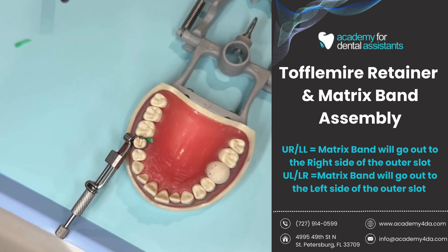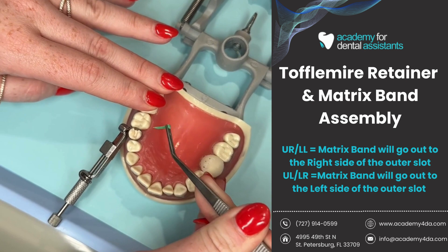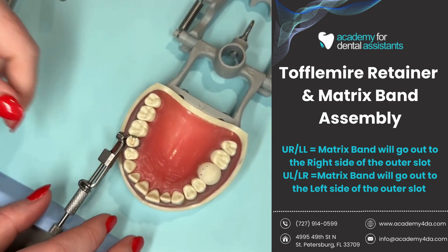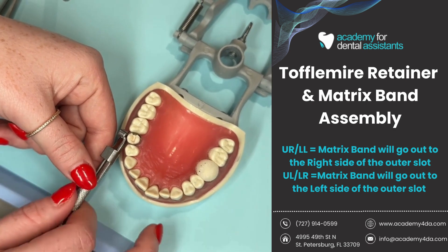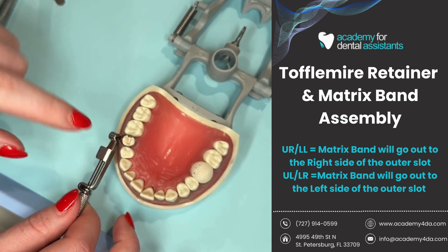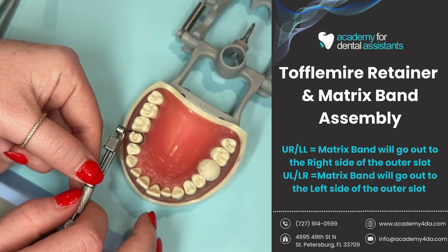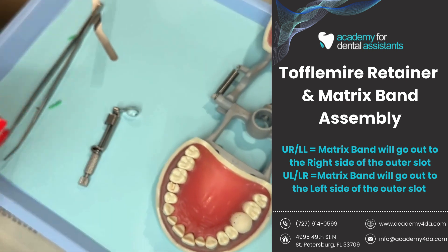To remove the matrix band, I use my cotton pliers to pull the wood wedge out and set it down. Next, I make sure there are no pieces of wood wedge still left over. Once I confirm I'm clear, I take my inner knob — the big one — and twist it to the left. That brings my diagonal slot back up towards the top, which loosens how tightly the matrix band is around the tooth. Once it's loose enough, I can just wiggle it off. And now it is disassembled.